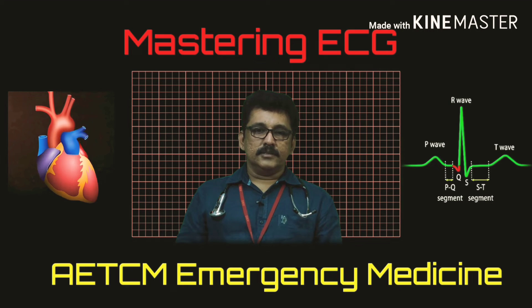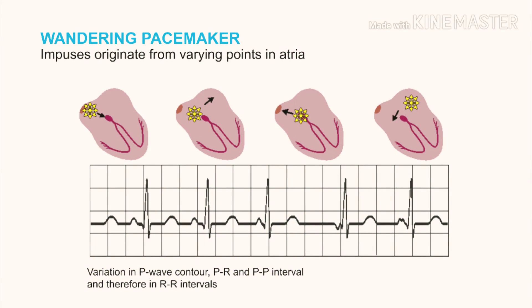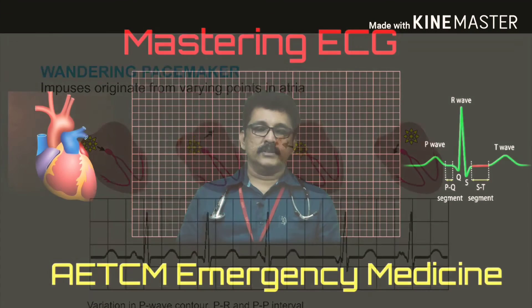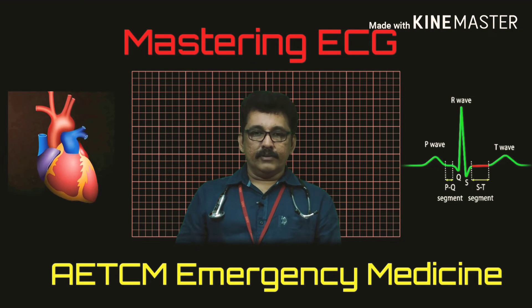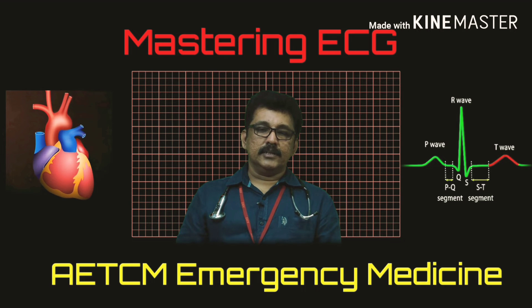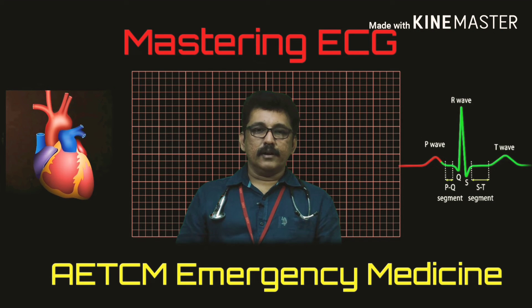This ECG shows a wandering pacemaker. You can see P-waves, but the morphology is different in each complex — the first, second, and third ECG complexes differ, and the fourth has inverted P-waves. Different morphological P-waves appear because the pacemaker varies from beat to beat — sometimes originating from the SA node, sometimes from the left atrium, and sometimes from the junction, causing a negative P-wave.